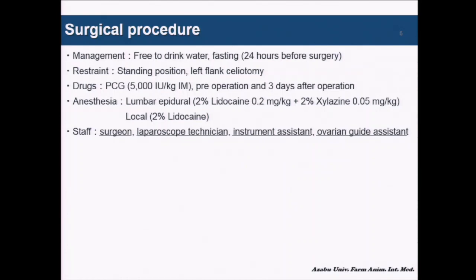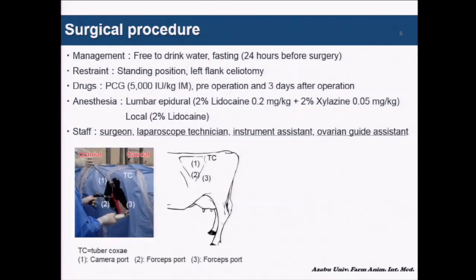Surgery was performed by a surgeon, a laparoscope technician, and an instrument assistant. In the guidance group, the ovary was guided by a veterinary technician. A 30-degree laparoscope was inserted through port 1, while two pairs of grasping forceps were inserted through port 2 and port 3.